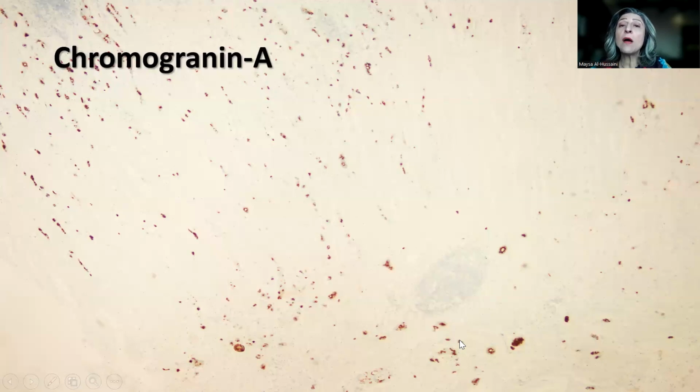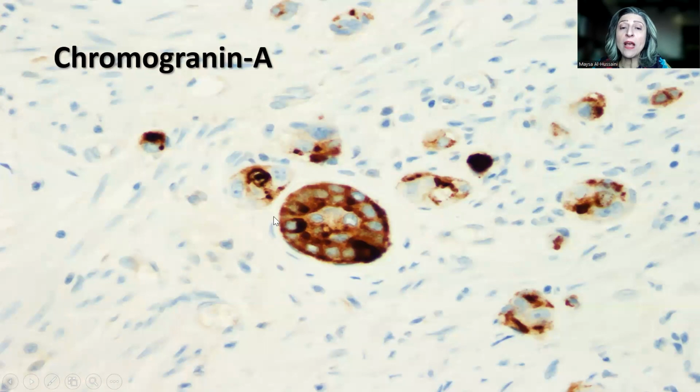And this is the most important immunohistochemical marker to render the diagnosis, chromogranin-A. And as you can see, it's really everywhere. It's diffuse infiltration of the wall of the appendix by the chromogranin positive tubular appendiceal tumor, and this is on high power magnification where we see beautifully the positivity with the chromogranin.